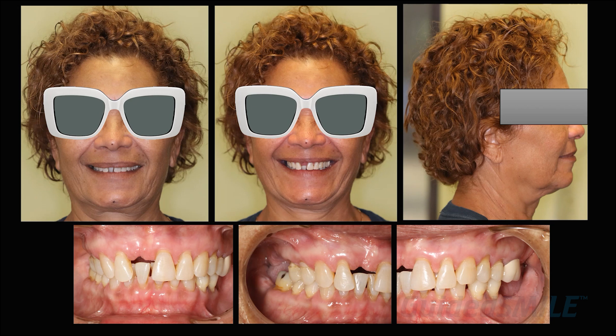Try very hard to get an exaggerated smile and then a nice profile image — these are excellent photographs. One thing to notice about the intraoral photos is that you get the full depth of field. This was taken with an SLR camera with a high f-stop, and the point is that you can see the teeth very clearly in the posterior and anterior, which helps our technicians when making sure the mounting is proper and the occlusion and bite is set perfectly.